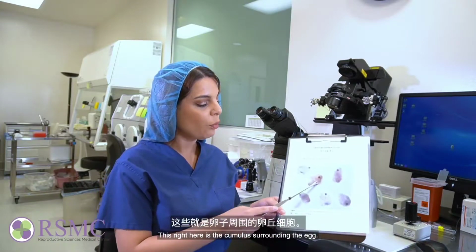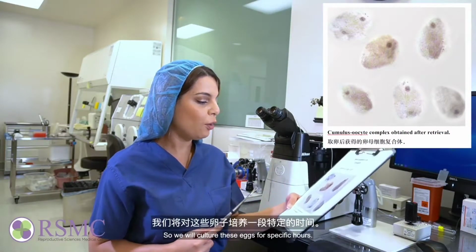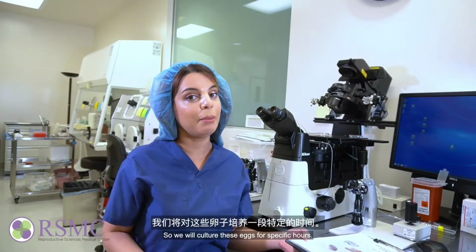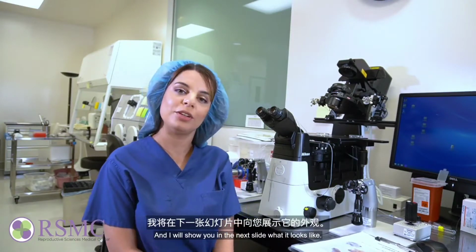And this right here is the cumulus surrounding the egg. So we will culture these eggs for specific hours, and then we will try to get rid of these cumulus cells. And I will show you in the next slide what it looks like.